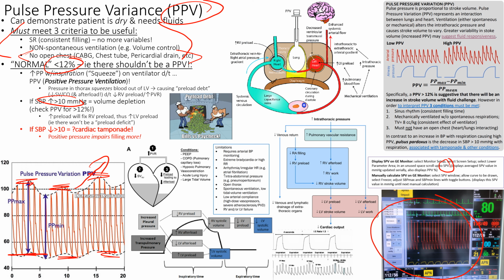So it's useful in that it can measure if you have a fluid deficit or not, or a preload debt, let's say, right? If you imagine you get a paycheck, and you spend the paycheck, and then now you're in debt. You're going to see a lot of swings in your bank account compared to if you budgeted correctly, which I don't, right? So that'd be something that you would be able to identify.